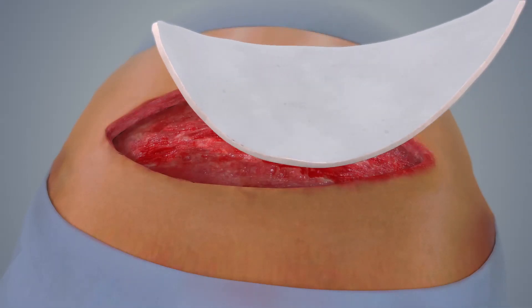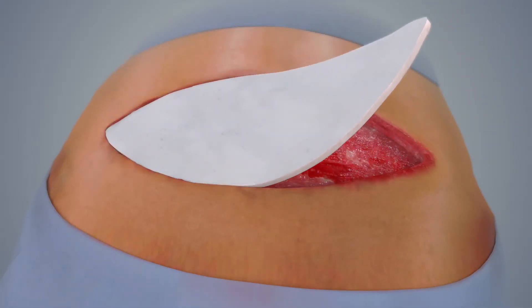Novosorb BTM is applied to a fully debrided wound and trimmed to abut the wound edges without overlapping.